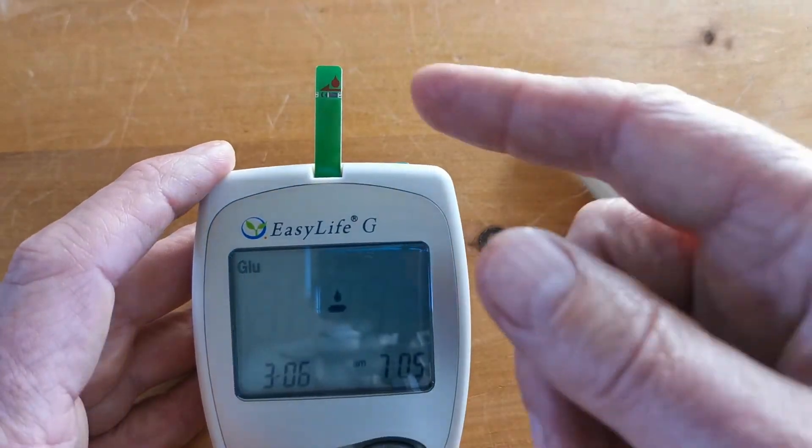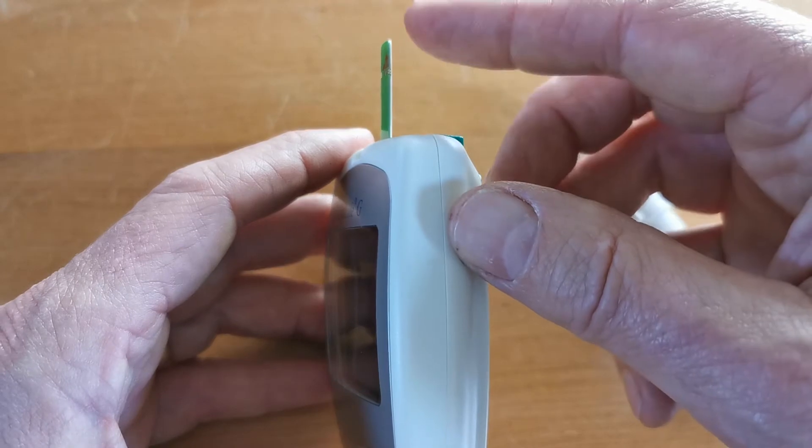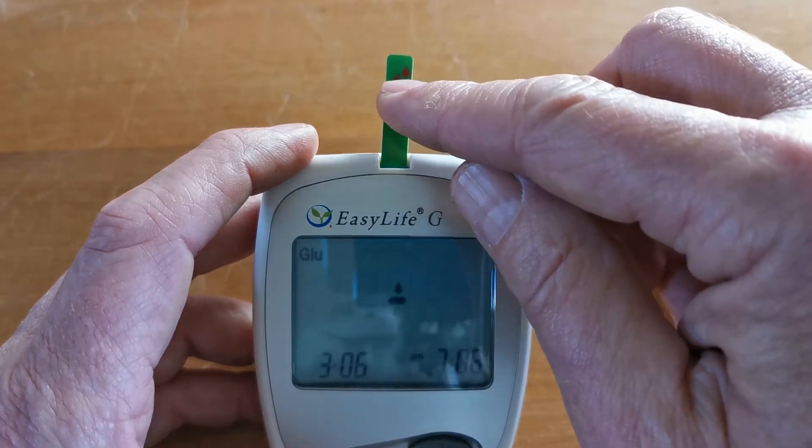The port on the test strip where the blood has to be applied is on the side of the test strip — this tiny, narrow aspect here. The port is at the level which corresponds with the indicator arrow.